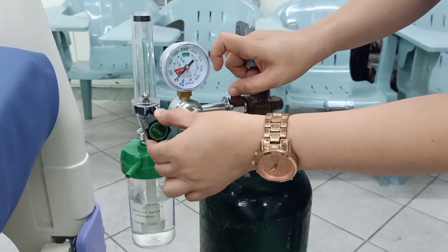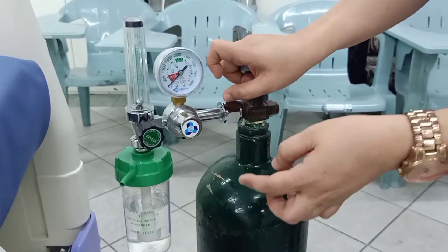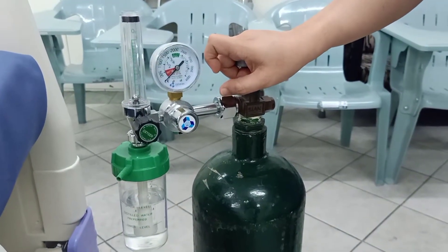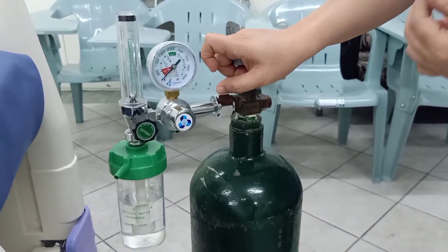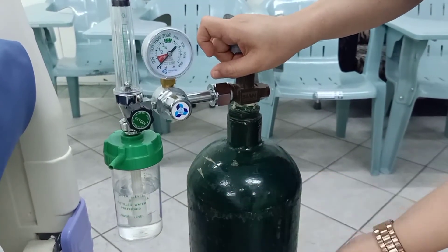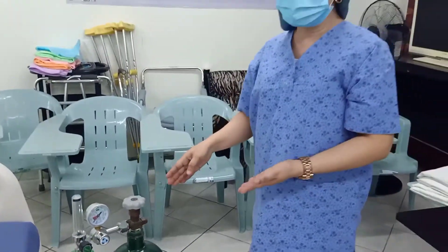This is the regulator and this is the humidifier, so that the air that enters your nose is already humid so that there may not be irritation on your throat. There should be water in it. And this is the tank. So those are the parts of the oxygen tank.